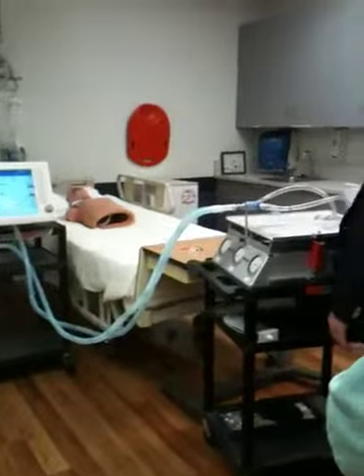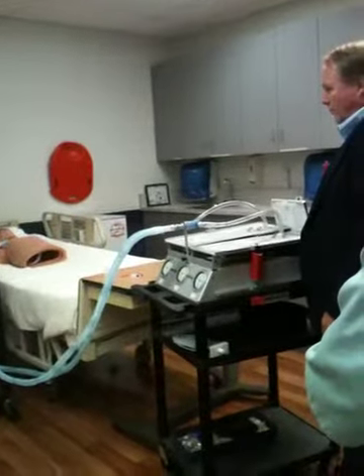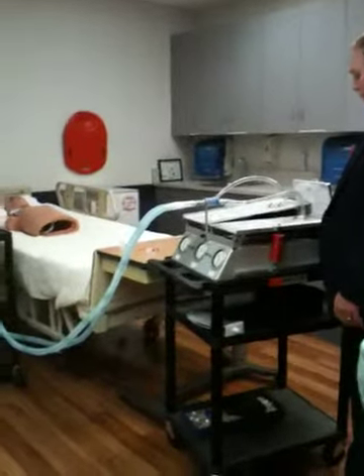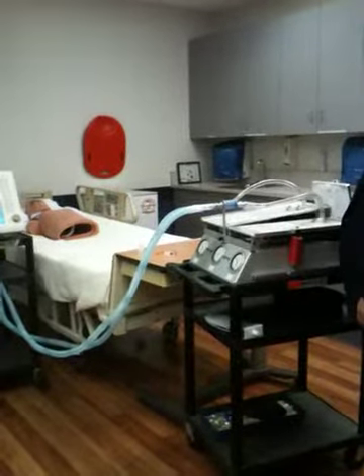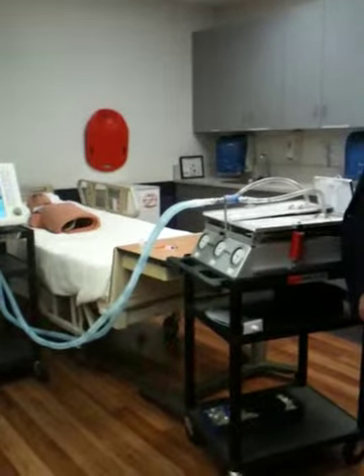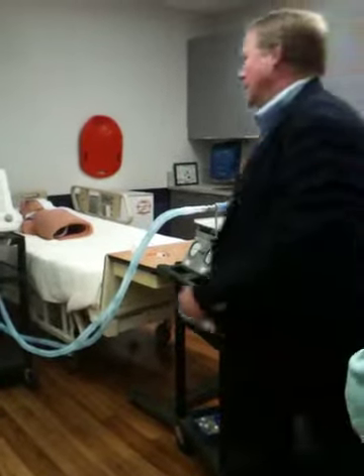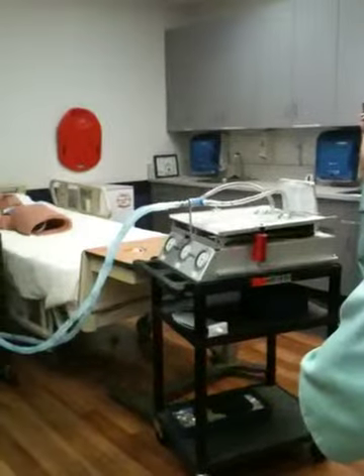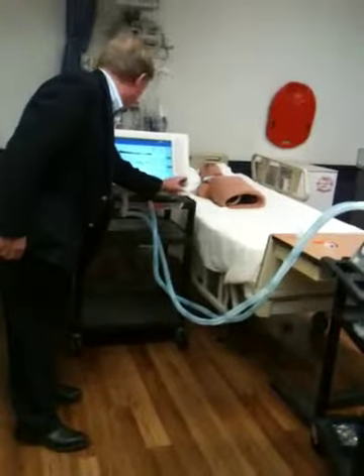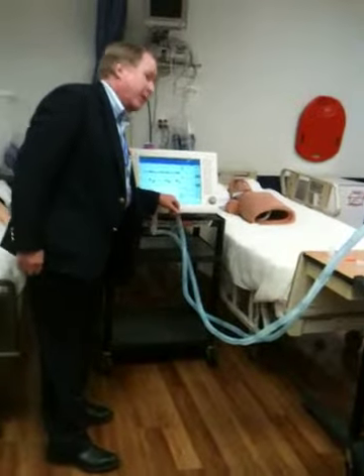So now we'll see what happens. Now we see how much straighter this is coming up. And again, I can pick within it. It's got a belly in the curve at the bottom here. I don't want that part. That is where my alveoli are going to close.